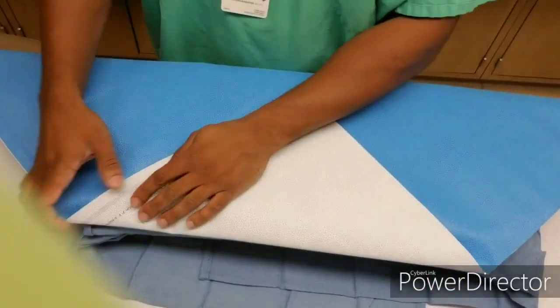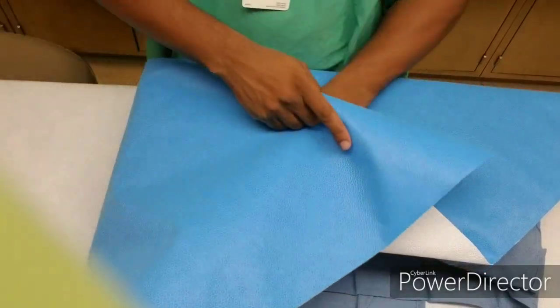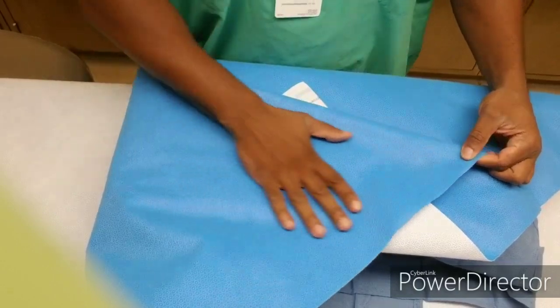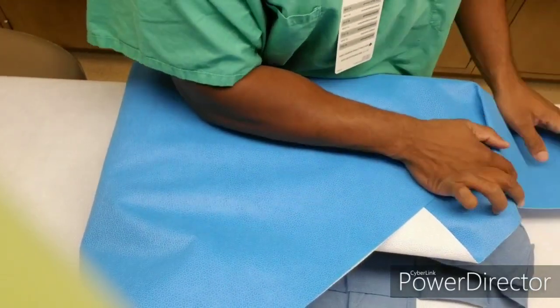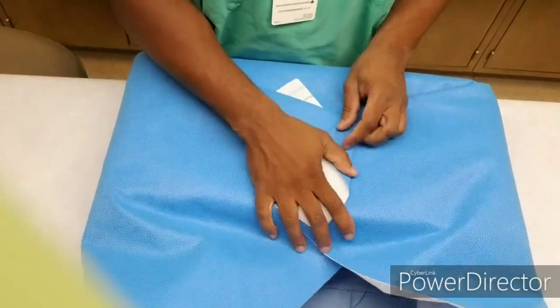You want to make it look neat. You want to pull the corners — the flaps. You know, make it look real smooth. Nothing too crazy looking.